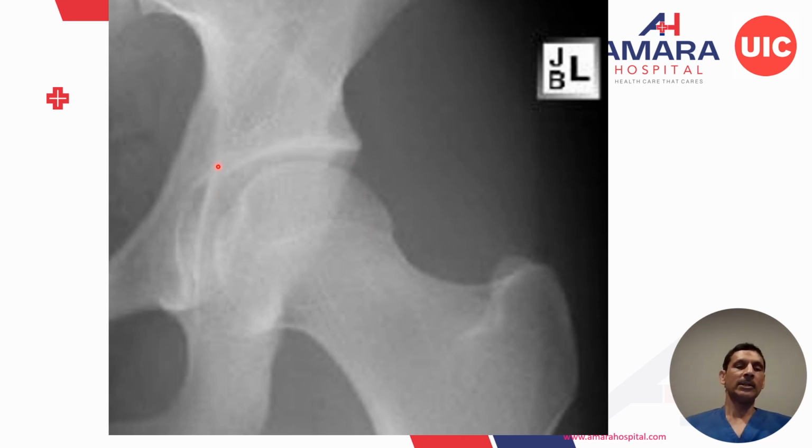And on the acetabular side, the teardrop and this ilioischial line, the teardrop is reversed, saying that the acetabulum is a little deeper. It's not a very accurate sign. It's just a gross thing to say that maybe the acetabulum is deep. That's the posterior wall of the acetabulum, and that's the anterior wall. So there's no crossover sign.